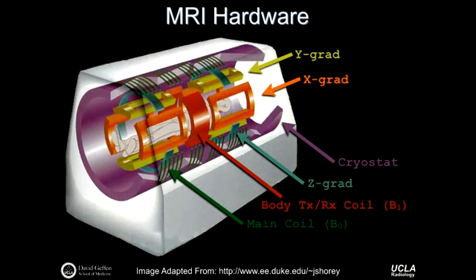If you look at it from a hardware perspective, this is the teardown that we've seen a couple of times, and we'll work towards describing all of these components mathematically as we go. But the thing we're talking about today is the so-called body coil. It goes by different names. Some people call it the B1 coil, other people call it the body coil. It is a transmitting coil, meaning it transmits the radio frequency pulses that we need for things like excitation.